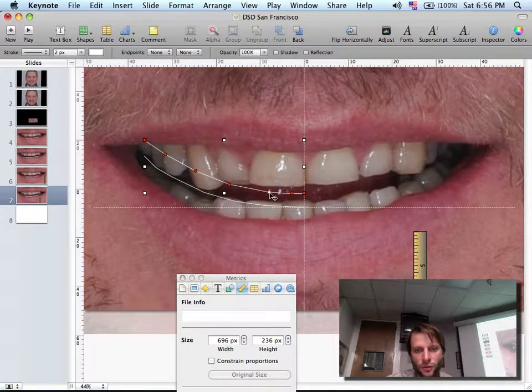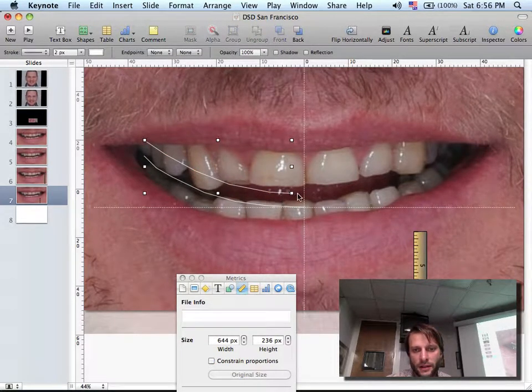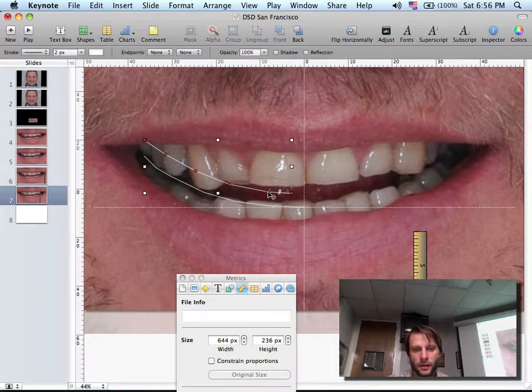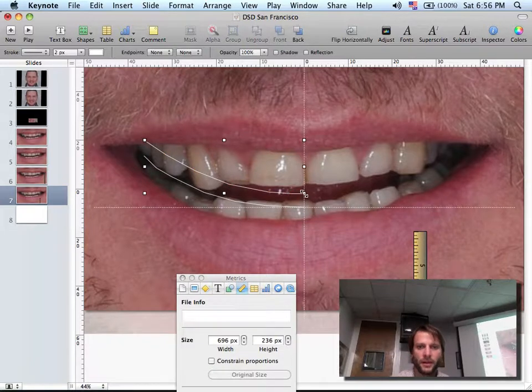If you want to reactivate the drawing, let's say by any chance I stopped the drawing over here and I didn't get to touch the midline, and I want one more dot. You double click here, you reactivate the dots, you double click on the last dot and the pencil is reactivated. You do whatever you want, continue the drawing. Want to finish, double click and the drawing is over.